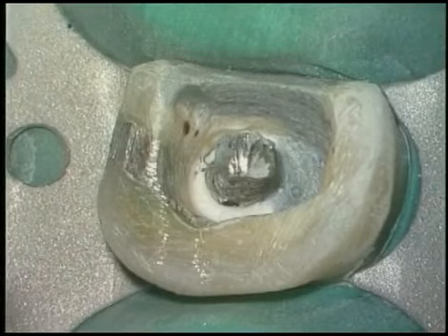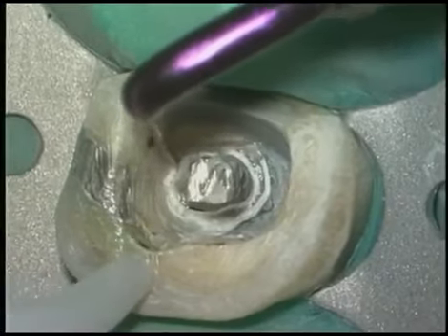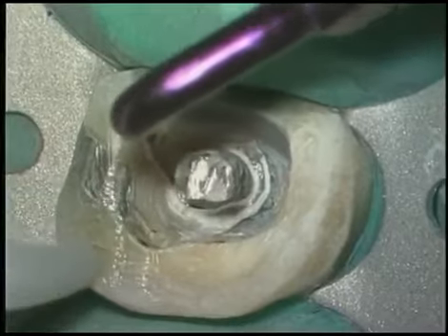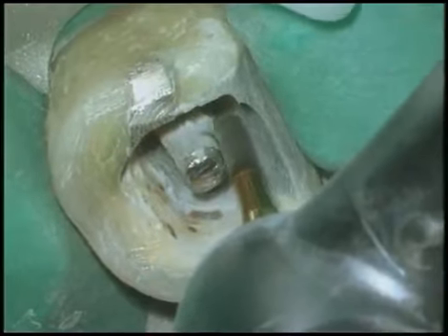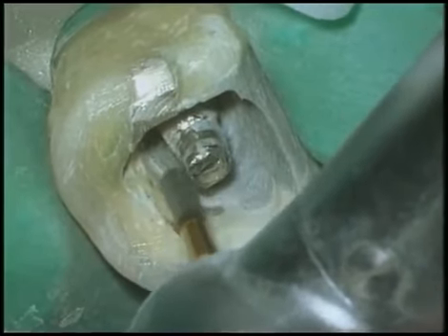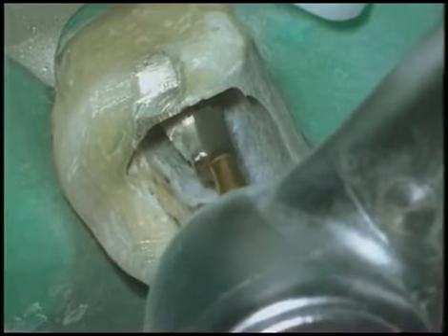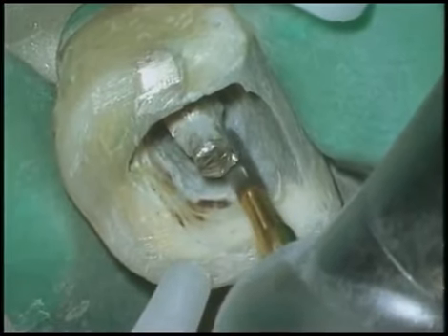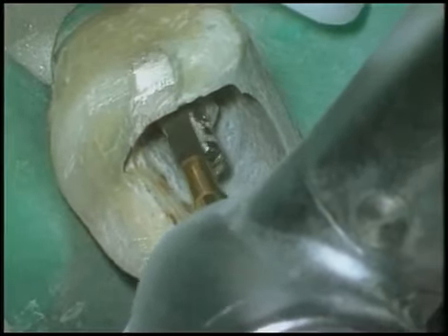Notice the cross-sectional diameter of this post. A Pro Ultra number 6 has a thin parallel wall profile and can fit nicely between the post and the axial wall and can be used to sculpt away restoratives. A transmetal burr is now selected to machine down the post. Some of these posts have such large cross-sectional diameters that it's wise to mill them down before commencing with using the post-removal system. This will reduce a lot of the trauma of using the trephines and prematurely wearing them out.